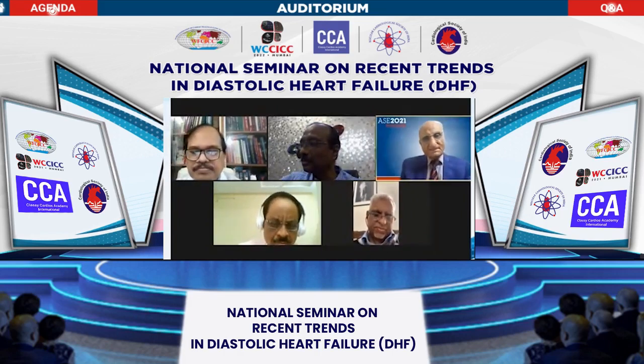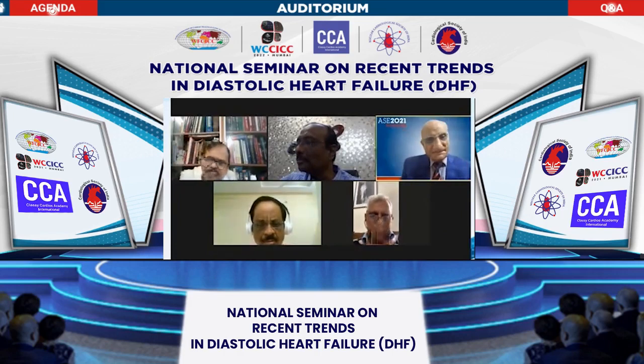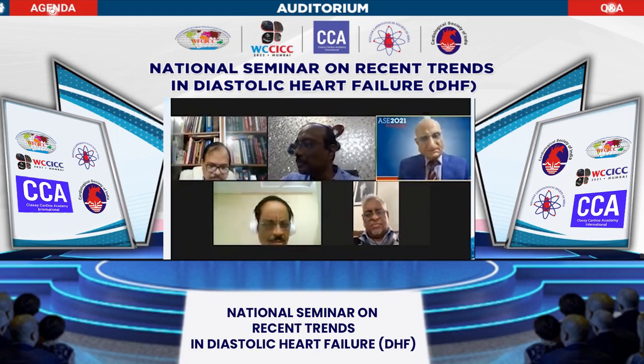No, early diastolic dysfunction is only like a grade 1 also. But definitely echo, if done properly, you start with a 2D echo. A 2D echo will tell us whether there is a diastolic dysfunction present or not. Suppose the LA is not enlarged, suppose there is no ventricular hypertrophy, suppose there is no hypertension.